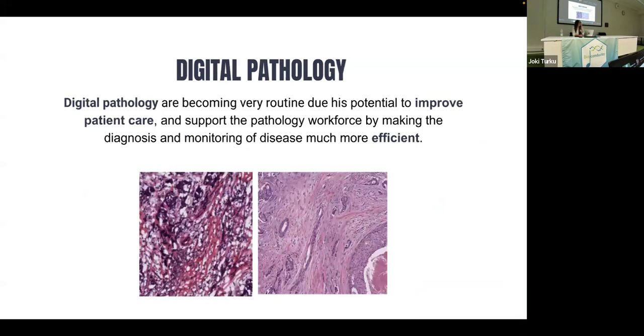For those who are not confident with digital pathology, it is becoming very routine these days, because there are a lot of new models that use the GPU, also foundation models and convolutional neural network models. With these models, the idea is to try to improve patient care and also support the pathologists in their work.